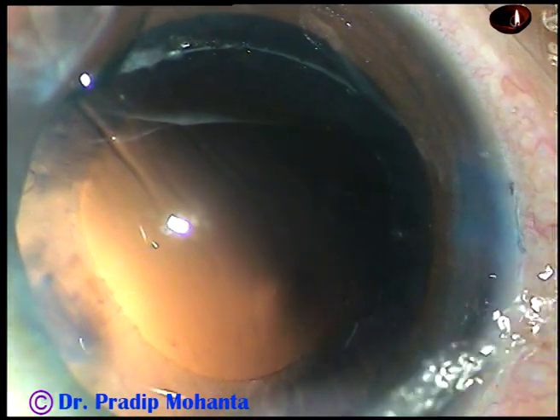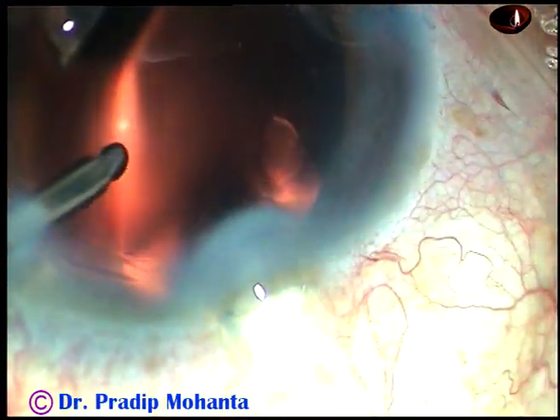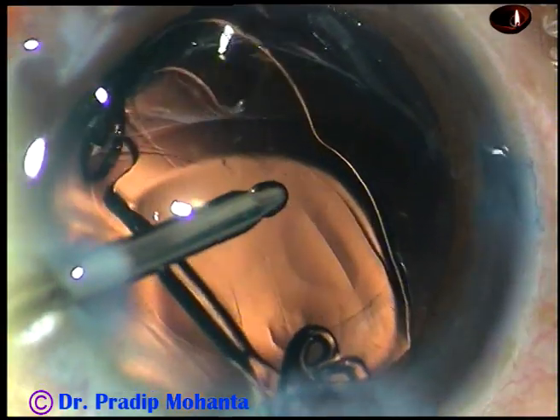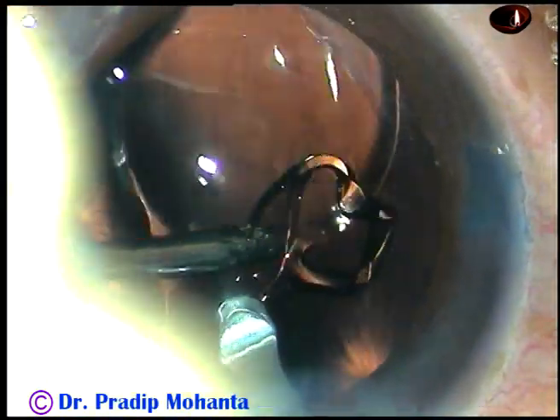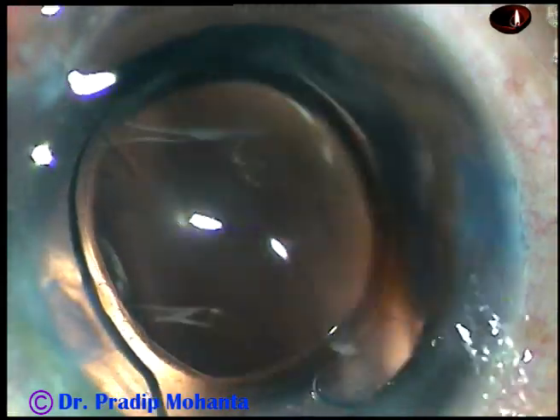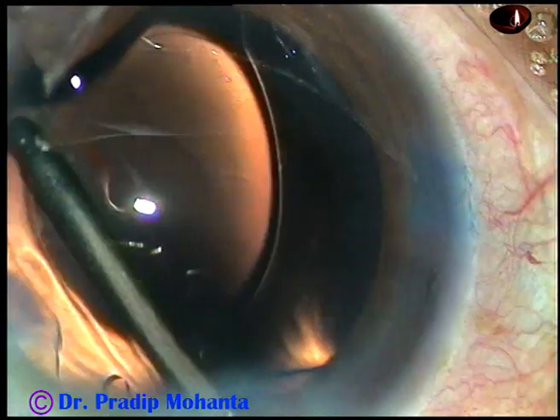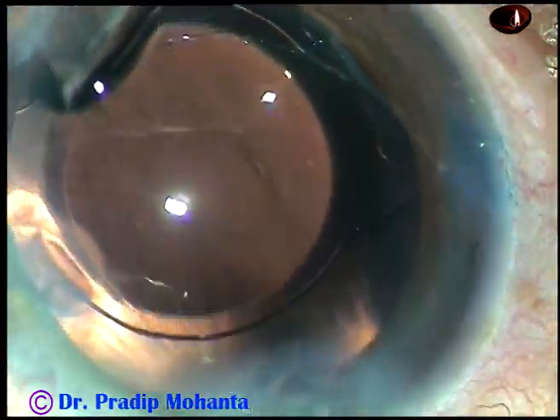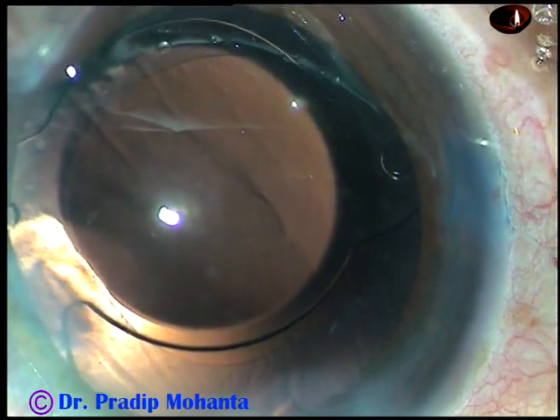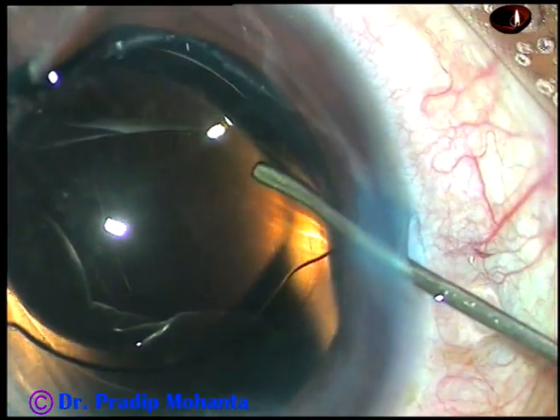Now this is hydro-implantation. This is not for beginners — this is for the expert surgeon. Just keep the anterior chamber formed and implant the lens. The left-hand instrument pushes the trailing haptic into the bag. So within 5 to 6 seconds you can implant the lens into the capsular bag. Since there is no viscoelastic, you don't have to spend a lot of time cleaning the visco.